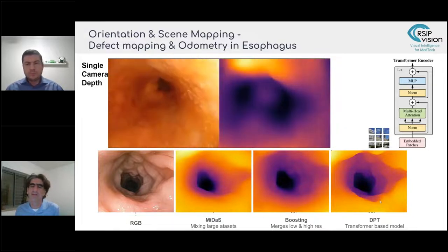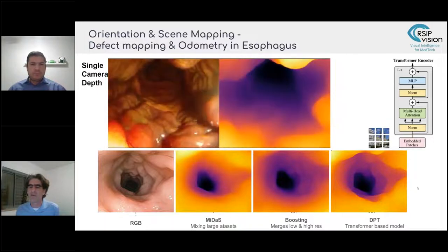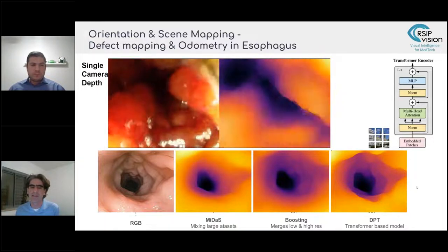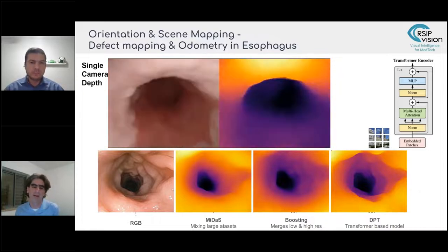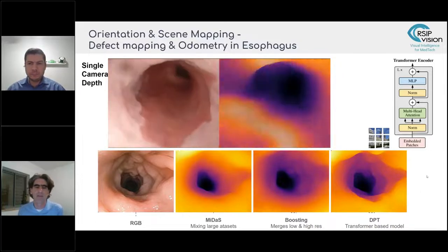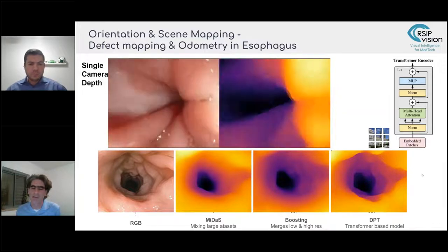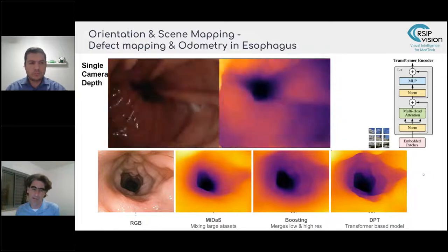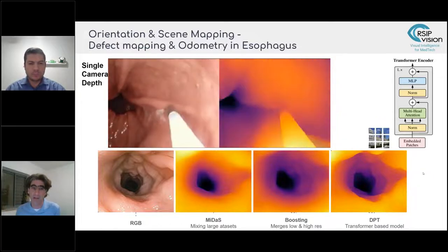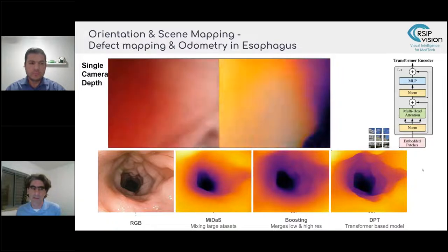And again, there are still challenges to really take transformers from the research or R&D state into reality because they tend to be data hungry. Again, the ability to train on multiple domain data sets makes this a little bit easier. There are also runtime challenges. They tend to be very heavy architectures, but technologically, we expect this to become more and more important over the next couple of years in the visual domain as well.